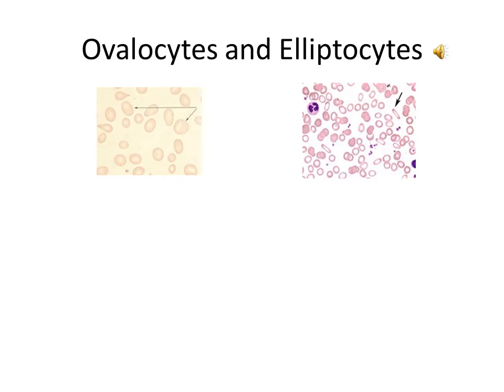While in many labs there's no differentiation between ovalocytes and elliptocytes, and laboratories call them just ovalocytes, it's important for us to know the difference. Elliptocytes are those cigar-shaped cells that you see on the right-hand side of the screen. Ovalocytes, specifically macro-ovalocytes, seen on the left part of your screen, are associated with the megaloblastic anemias.